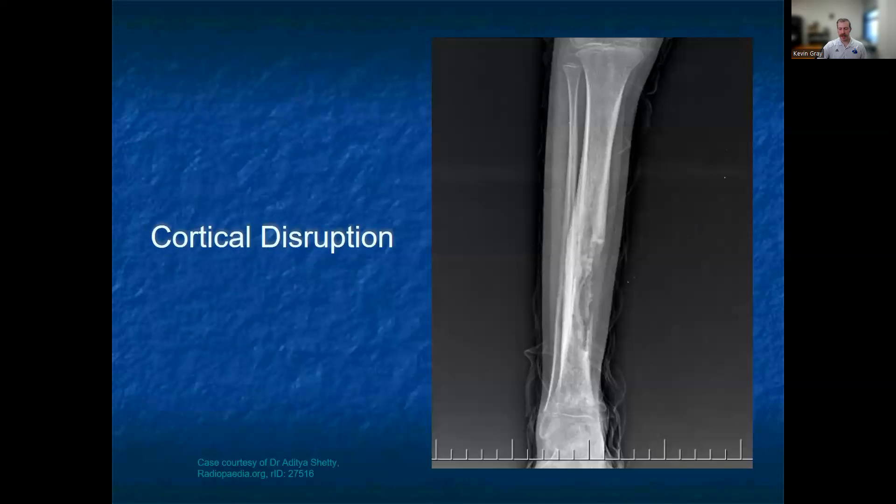Finally, as in this image, we can see full cortical disruption, where you lose and obliterate the signal of the typical cortex of the bone.